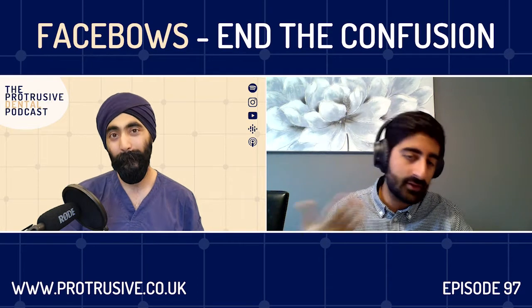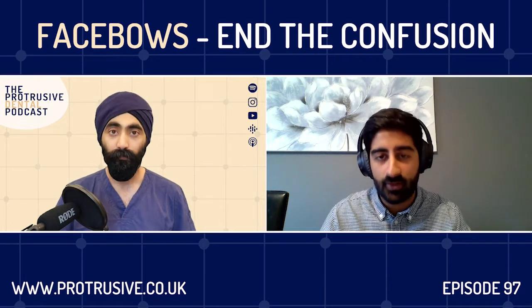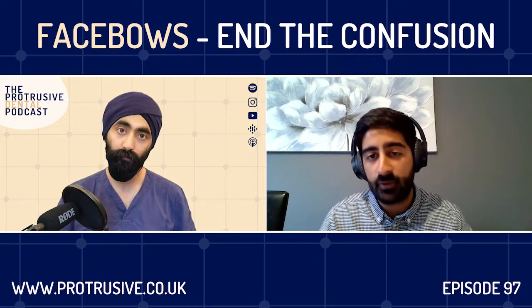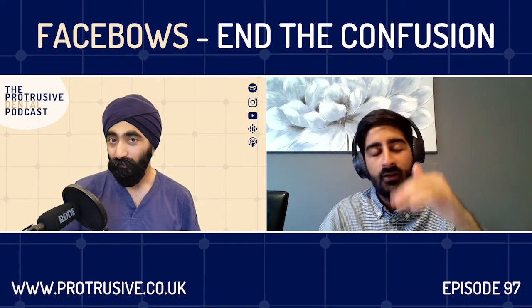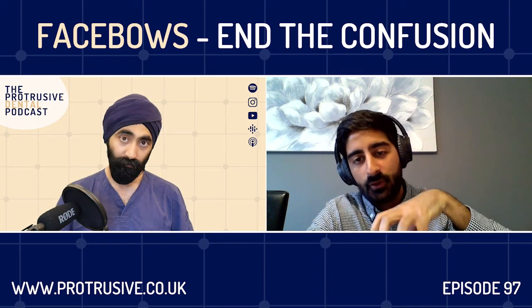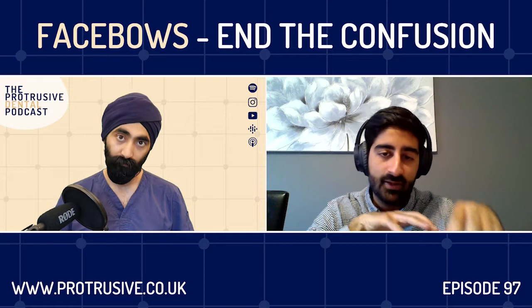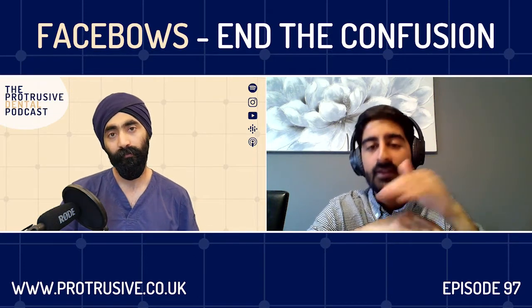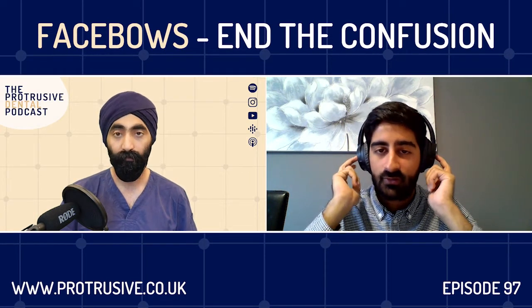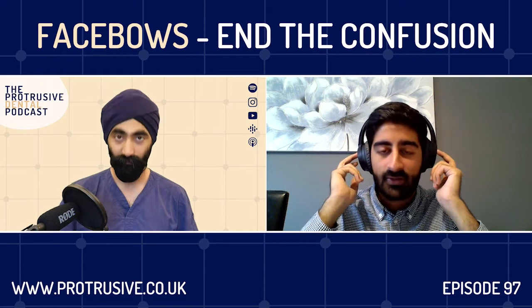So these are the regular ones that we use at the Eastman Dental Hospital for our regular cases. And these are the ones that accept Facebow records. And so what that Facebow record does is, for those who don't understand the Facebow, your maxillary cast will sit on top of your Facebow record. Your Facebow record inserts into your articulator, and then that maxillary cast gets stuck into the articulator at the correct position. And so this semi-adjustable articulator has a fake jaw joint on it. So it's Arcon if it looks like a jaw joint.